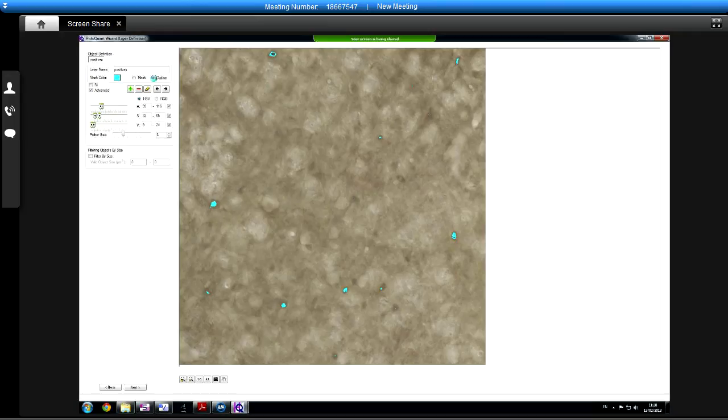And then the other thing, and this is especially useful for things like nuclear counts, if you click the fill button, then what it actually does, so if you look here, for instance, below a certain size threshold, I think it is, which I can't remember, it just assumes it to be one object. So if you're marking something like cytoplasmic background, say, not really necessarily relevant, but if you've got nice regular shapes like this, because otherwise you can sit there and go, oh, why is it not considered that one, trying to click more and more in the middle and that type of thing.